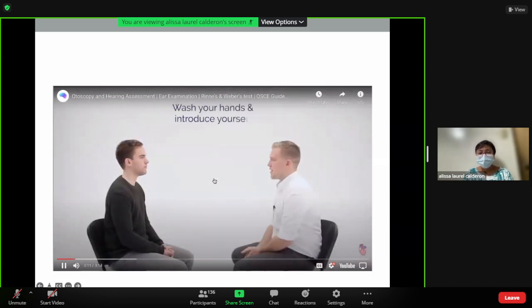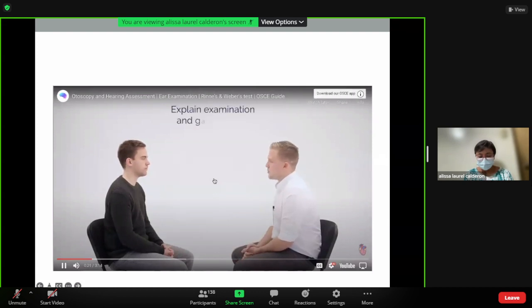Hi, my name is Andrew, one of the final year medical students. Could I just confirm your name and date of birth, please? Sure, it's James, 13th of December, 1989. Nice to meet you, James. Today I'd like to examine your ears. This will just involve looking inside the ears with a piece of equipment called the otoscope, and then using a number of different tests to examine your hearing. Would that be okay? Yeah, that's fine.